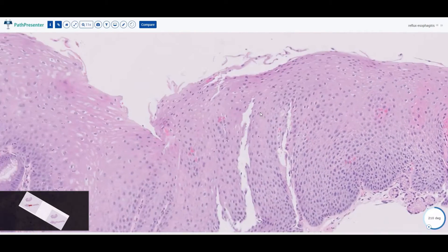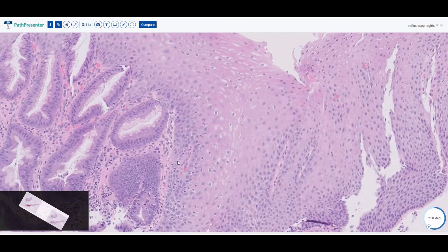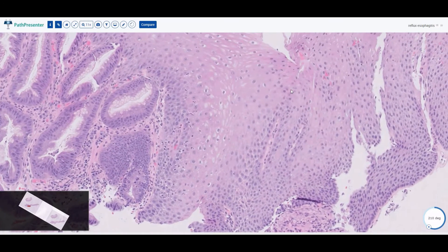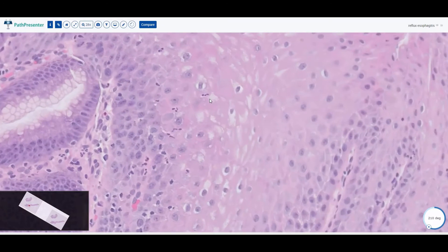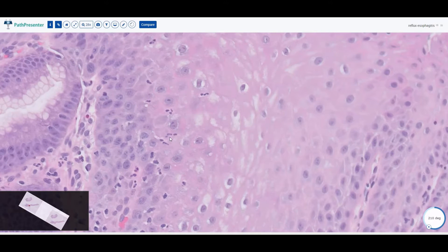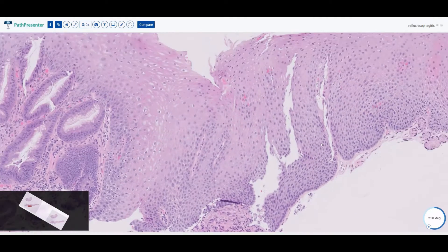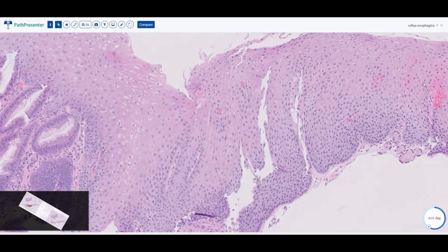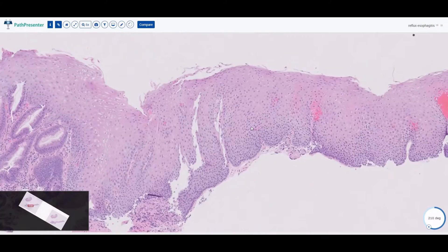Another finding that would suggest reflux esophagitis is some amount of active inflammation. Once again you see that this area has an increase of the basal layer, papillae that go very high up into the epithelium, and inflammation — we see neutrophils here, this one, this one, these are all neutrophils. With the combination of neutrophils, the increase in the basal layer, and the elongation of the papillae, these are all features found in reflux esophagitis.